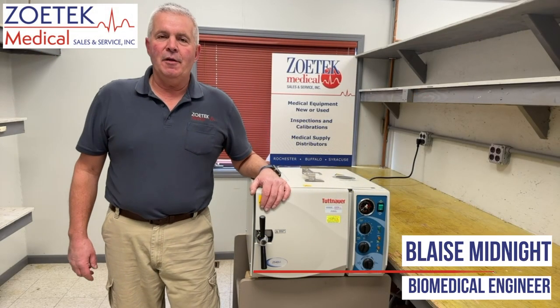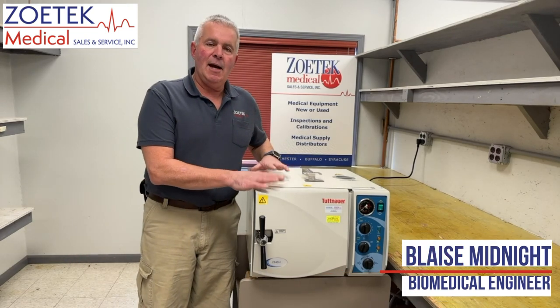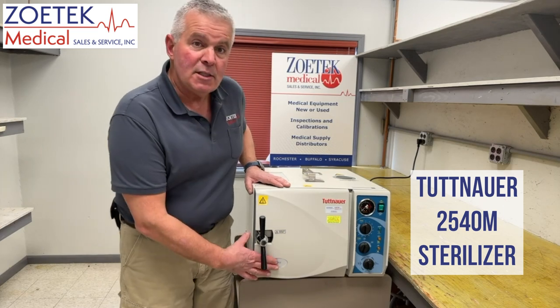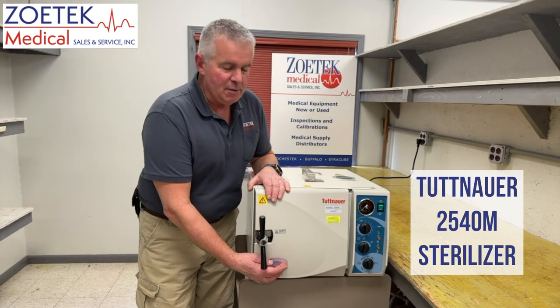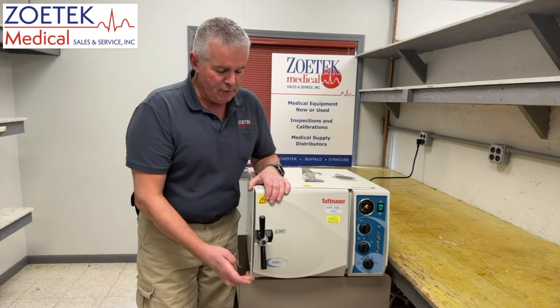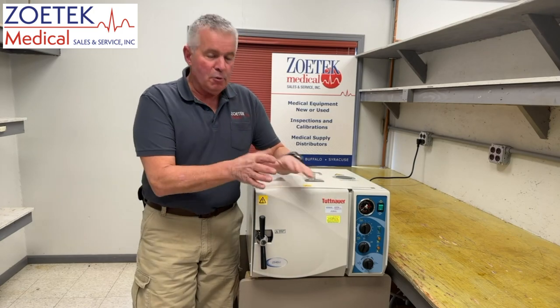Hi, this is Blaze Midnight with another Zotek Tech Tip. Today we are going to talk about the operation of a Tuttenauer 2540M sterilizer. The M is a manual sterilizer, which means you have to manually operate the valves. The 2540A would be automatic, but today we're doing the M.